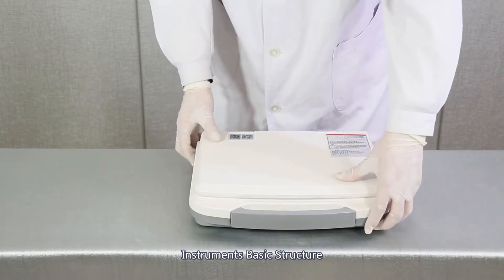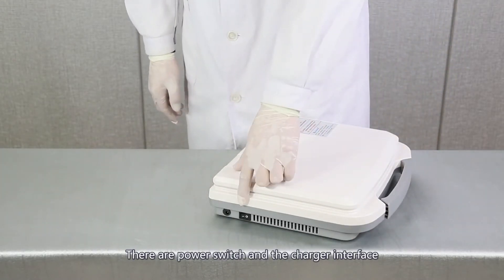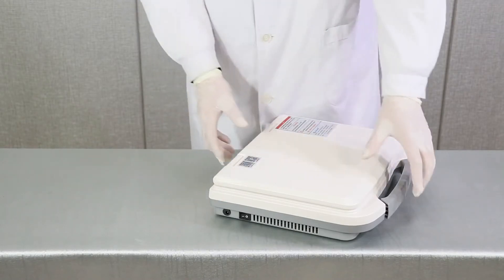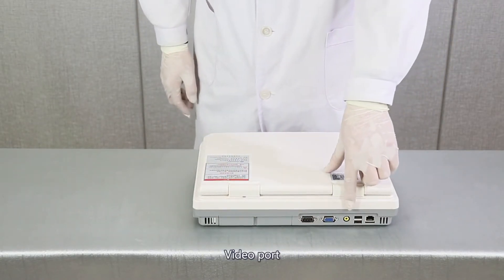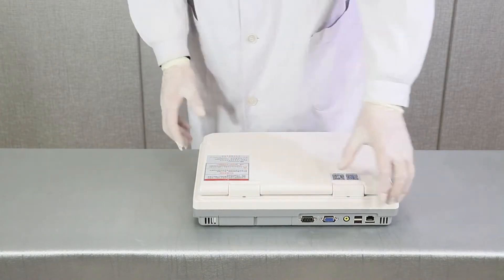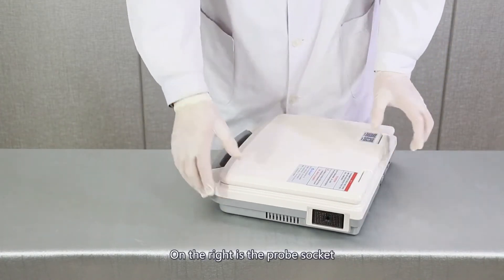Instrument basic structure. On the left of the machine, there are a power switch and a charger interface. On the back, there are a USB port, video port, VGA port, and battery. On the right is a probe socket.